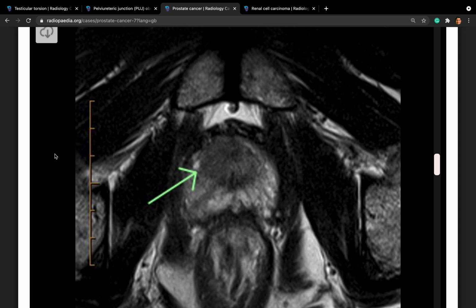Why do you select MRI scan for evaluation of increased PSA? Because that's the NICE guideline now that any patient with curative intent or likely to have radical treatment for prostate cancer, it's advisable to have an MRI scan upfront. And that's proved with the PROMIS trial that showed that MRI scan increases the sensitivity for detecting clinically significant prostate cancer, and showed as well that if someone had an MRI scan upfront, 1 in 4 could have avoided biopsy. And MRI scan has a very high negative predictive value of around 90%.